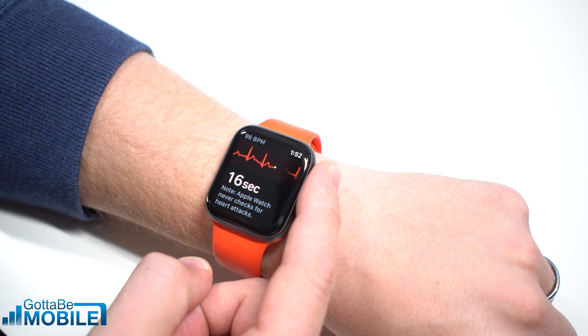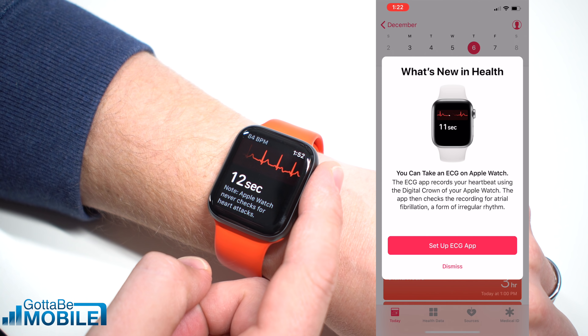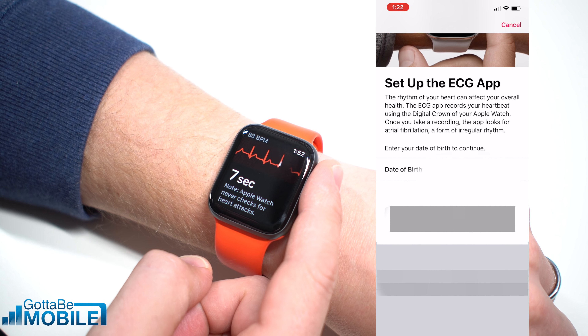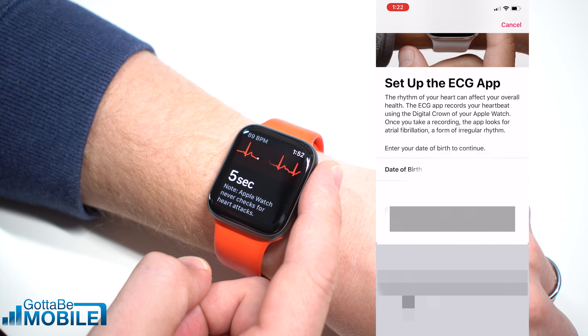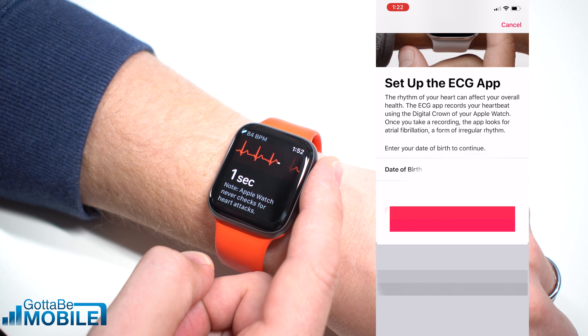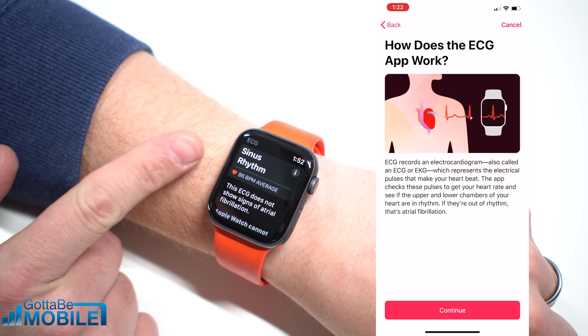Now the first time that you do this, you're going to have to set up a few options in the Apple Health app on your iPhone, which you're going to see on the right side of your screen right now. That's really just filling out a little bit of information about yourself, including your birth date and if you have AFib already.